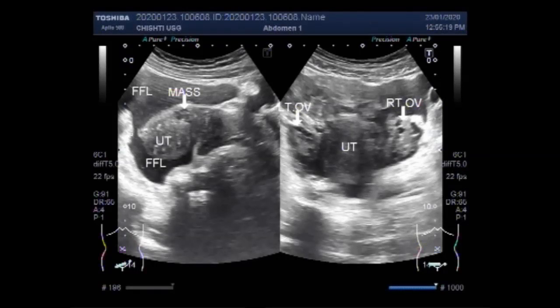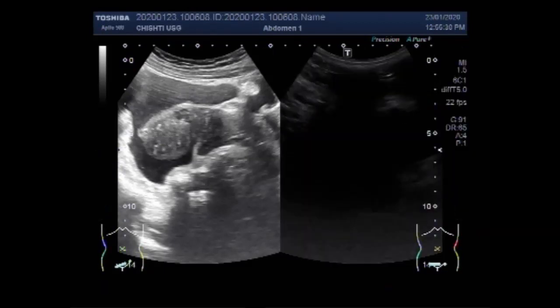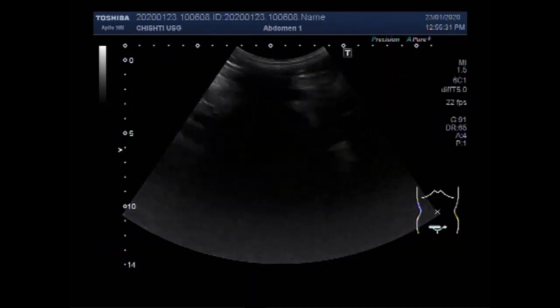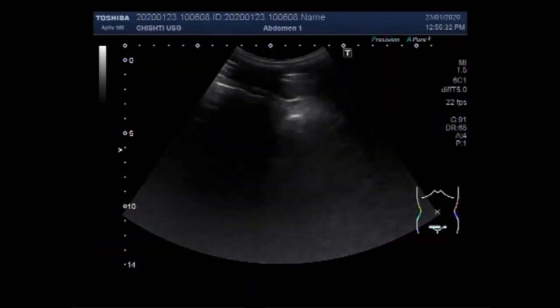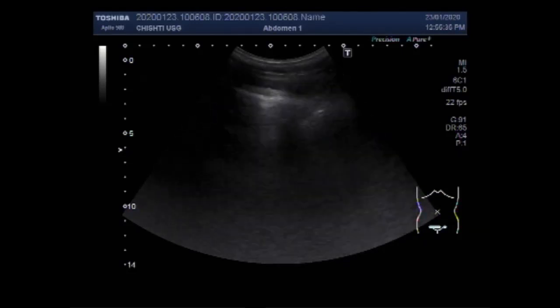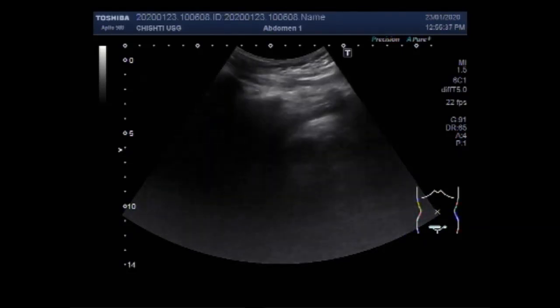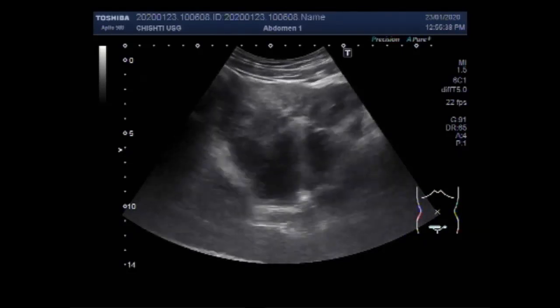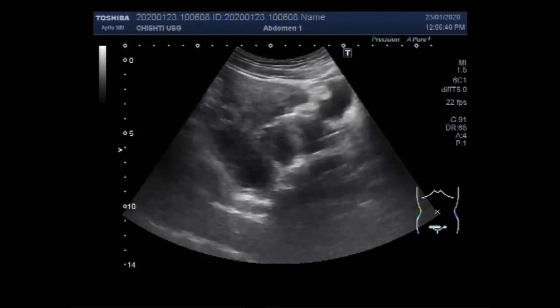Dear viewers, I hope you are all fine. This ultrasound video shows scanning of a patient with ruptured ectopic pregnancy, ruptured fallopian tube. The pregnancy is in the fallopian tube.